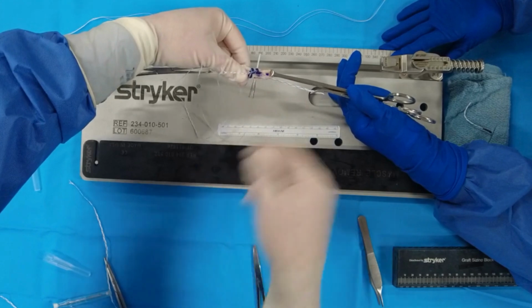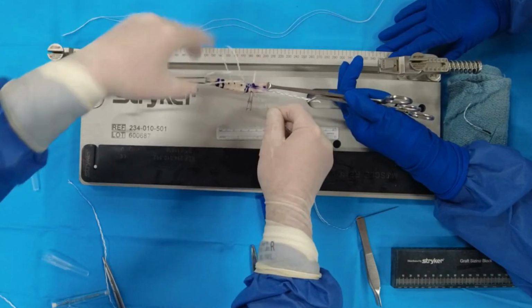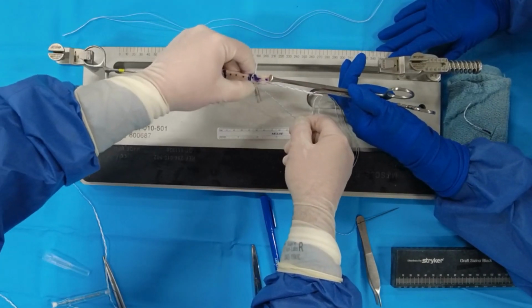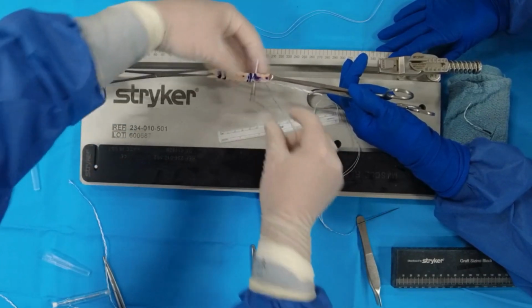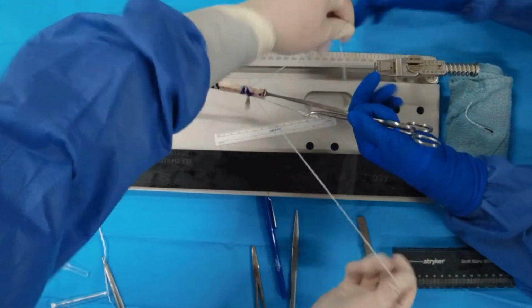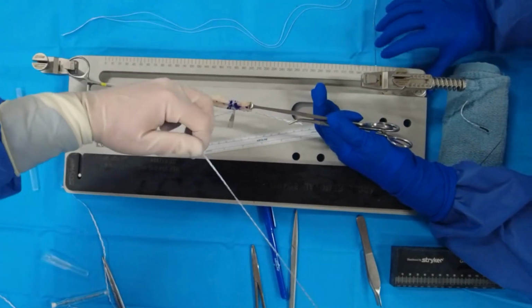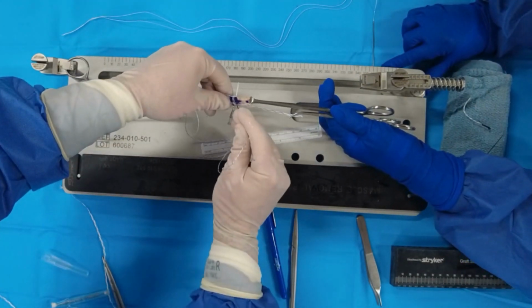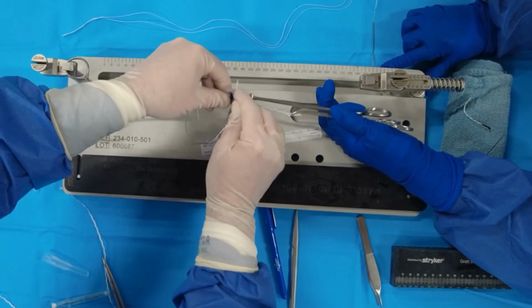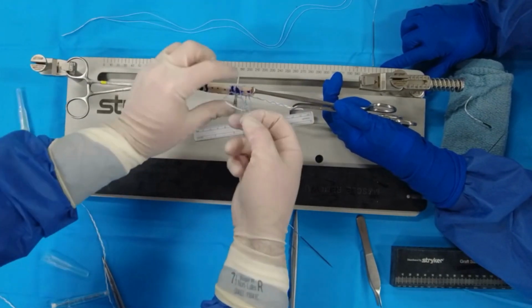A great article in 2015 with Drs. Kroll and Gilmer. And this is how I started out by doing intra-graft fixation, is you can make a split at the end of the tendon with a 10 blade and then utilize the natural split on the proximal aspect. So you can place either a closed loop or other suspensory construct through this and then whip around it. However, there is some risk that you're going to capture suspensory, and in fact, this happened to me in 2 cases, which is, of course, very devastating when you go to reduce your suspensory and find that it won't do it because you've captured it. And so this is going to keep you out of a lot of trouble by doing it.